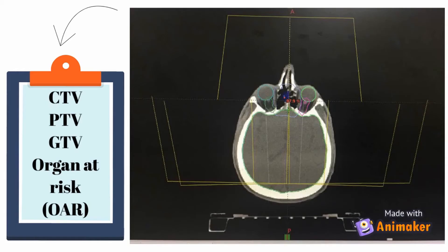The organs at risk included the brainstem, PRV brainstem, spinal cord, PRV spinal cord, optic nerve, chiasm, parotid gland, mandible, temporal lobe, eyes, lens, oral cavity, tongue, glottis, brachial plexus, and aorta.